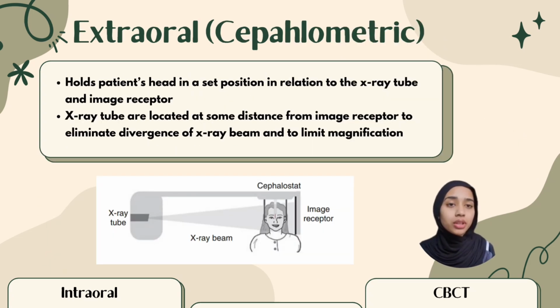Next, for the extraoral imaging, we have the cephalometry. The principle of cephalometry is rather simple, where the patient's head is positioned in relation to the X-ray tube and the image receptor for us to obtain a true lateral image or a PA image.